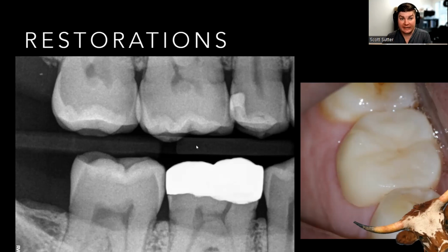So the dentist had, to her credit, flattened out the occlusion. Look, there's really like no anatomy on 30 if you look at the picture of it, but look at the cusp on 3, and no one had adjusted this. This was what was causing all the pain down here. That's why the bite wing is so useful, because now that you see it, it's almost impossible to unsee it.